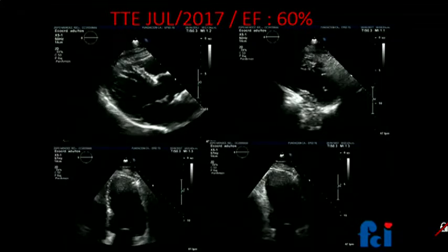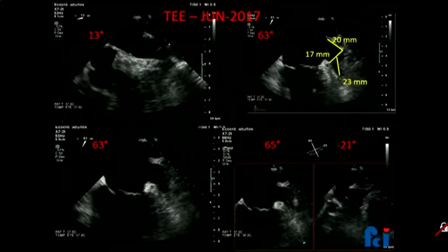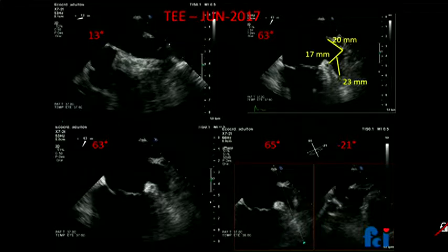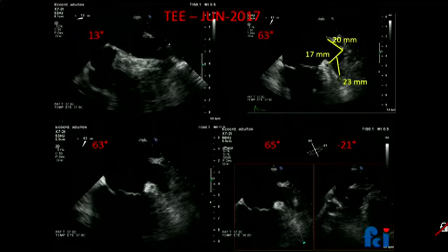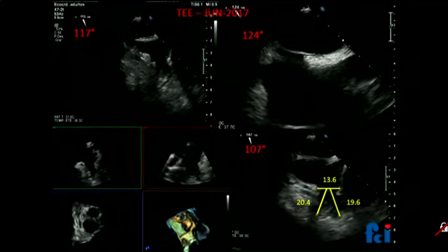The patient was studied and routine tests were done. The ECG shows no significant alterations. Another study with different views shows an ostium of approximately 17 millimeters, a distance to the end of the appendage of 23 millimeters, and measured from the ridge at 20 millimeters. A line is drawn perpendicular to the circumflex. Here we have the recommended fluoroscopy angles.